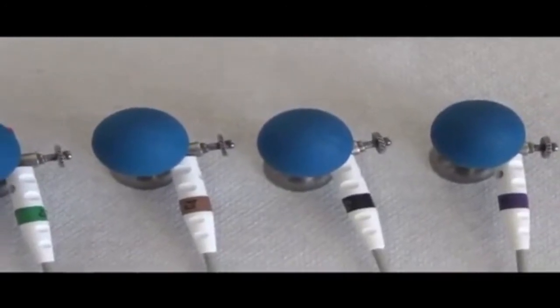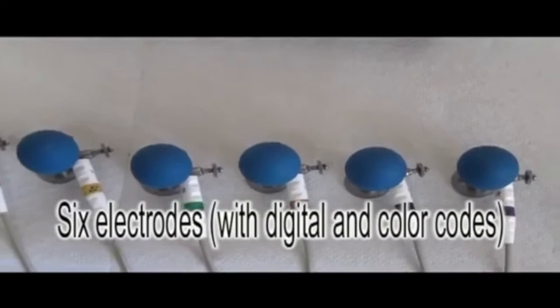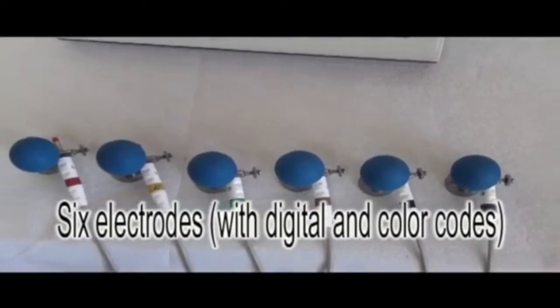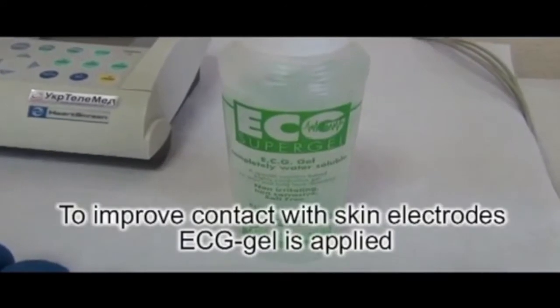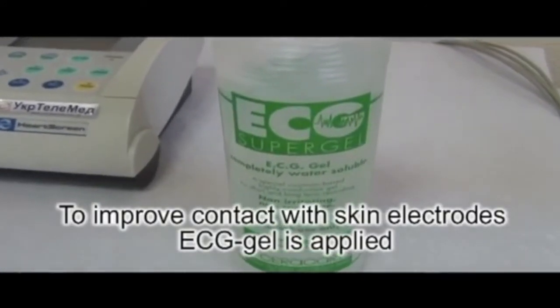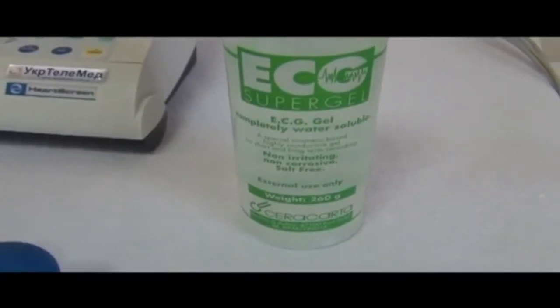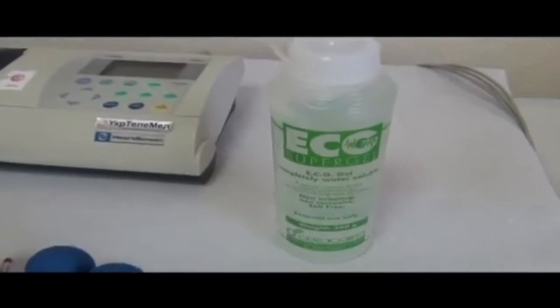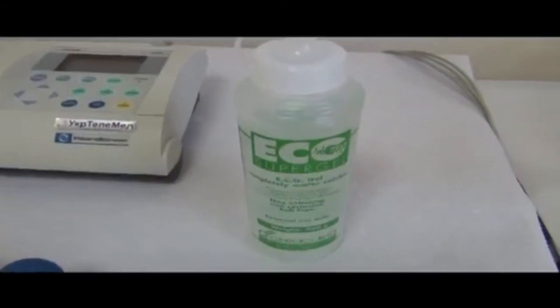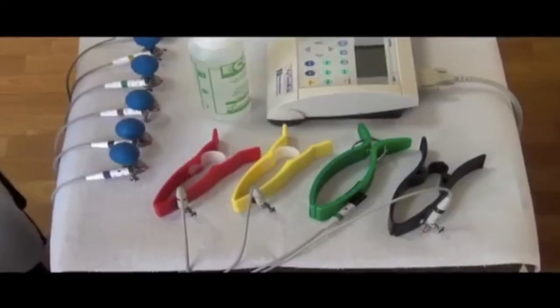They have both color coding and numbering. To improve electrical conductivity and contact of electrodes with skin, we use special gel. If you don't have this gel, you could use saline. Before recording the ECG, you should apply gel directly on the electrodes and a small amount on each electrode before placing it on the patient's body.